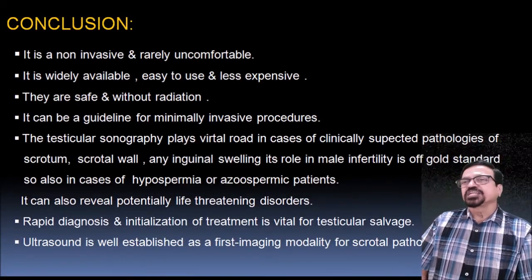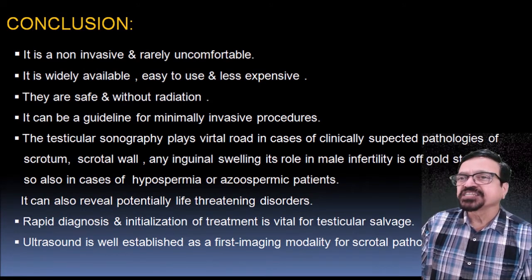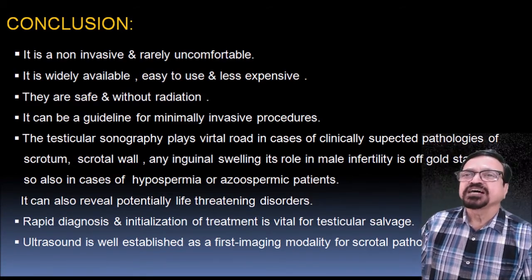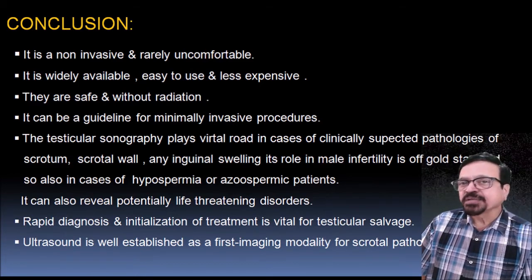Now, let's come to a conclusion. We have seen different pathologies of the scrotum in different lectures. We have a total of 7 lectures in which we have covered multiple pathologies. To sum up, where we stand when ultrasonography of scrotal masses is done: it's a non-invasive and rarely uncomfortable investigation. It is widely available, easy to use and less expensive. It is safe and without radiation. It can be a guide for minimally invasive procedures.